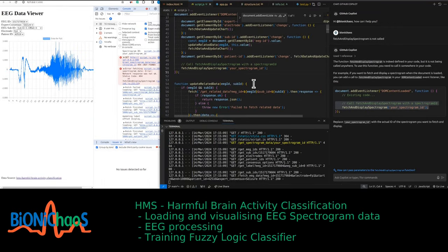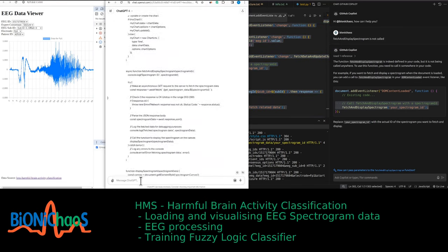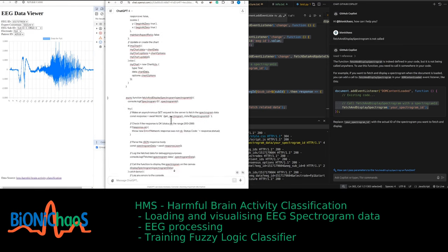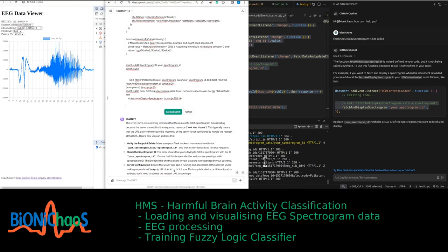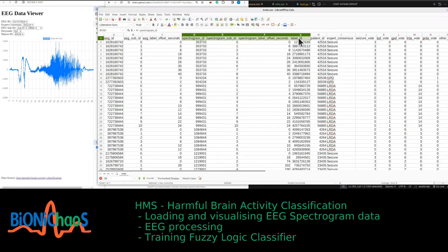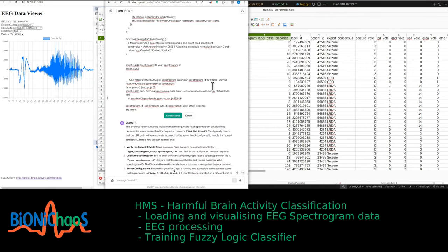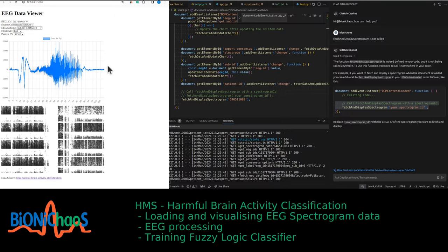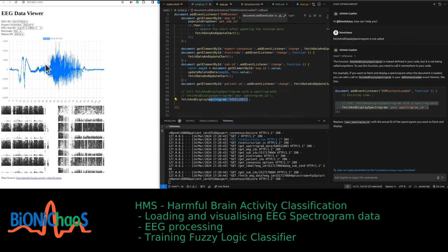Where do we get the spectrogram ID? It should be fetched from the data file — let's see if Copilot gets the context. It did not get the context. The spectrogram ID — not sure about the label, probably not relevant — but all those are in the train CSV file. Let's see if it gets it now. It is a placeholder.